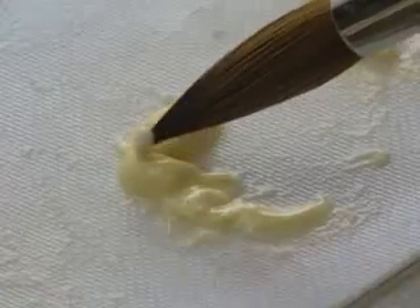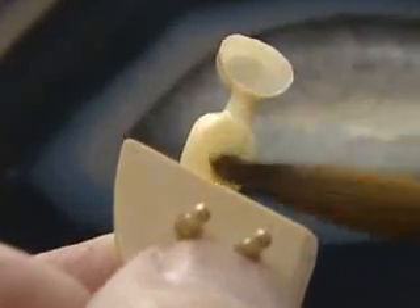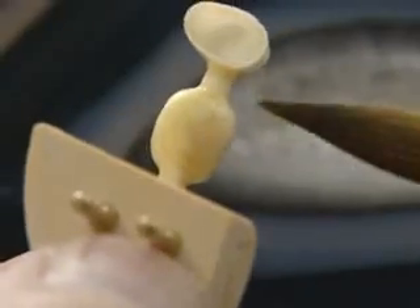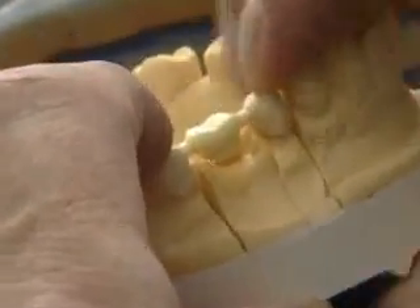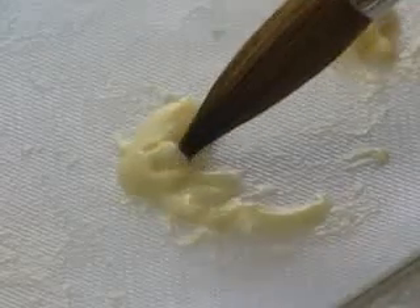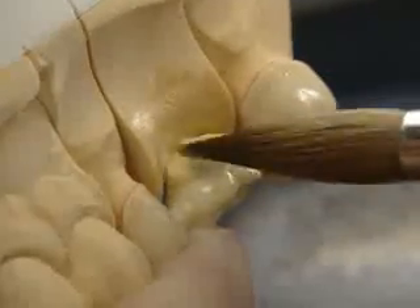The basal chromatiser warm chroma is applied onto the pontic and afterwards the bridge is placed on the model. The colour intense chromatiser provides deep colour intensity and is used cervically and under the pontics.